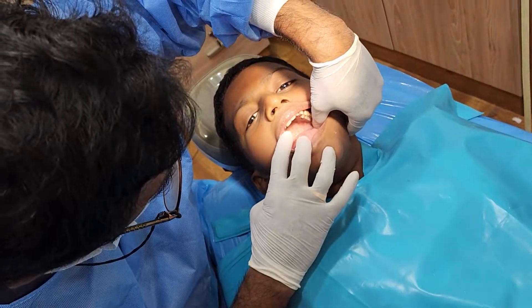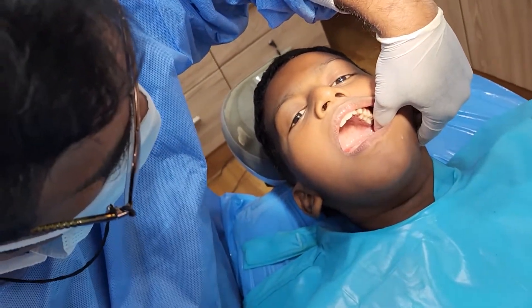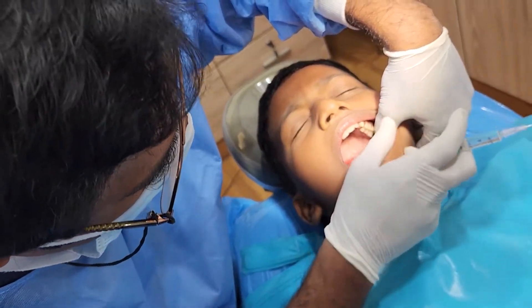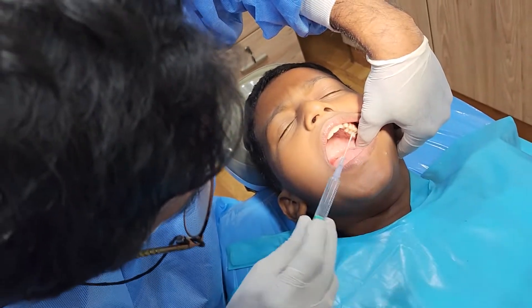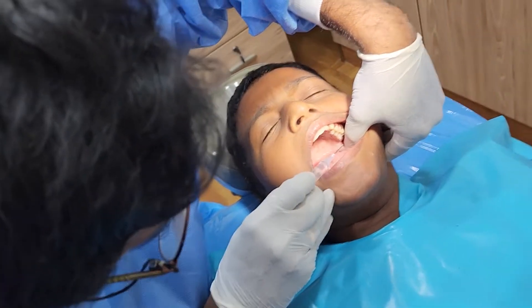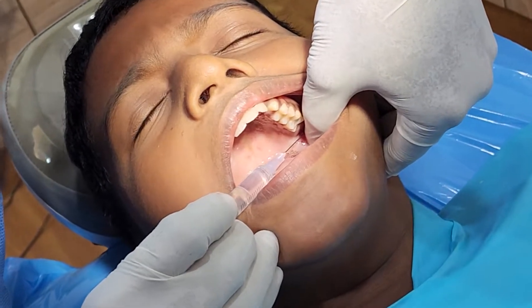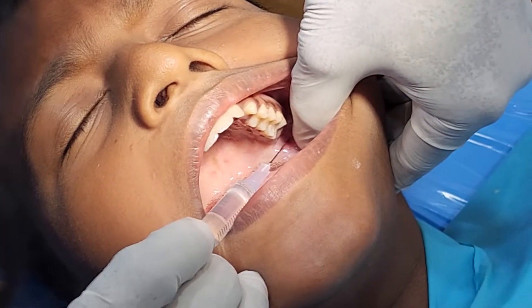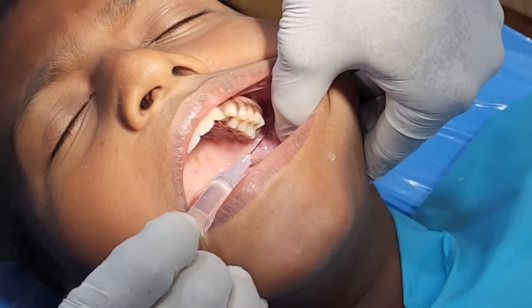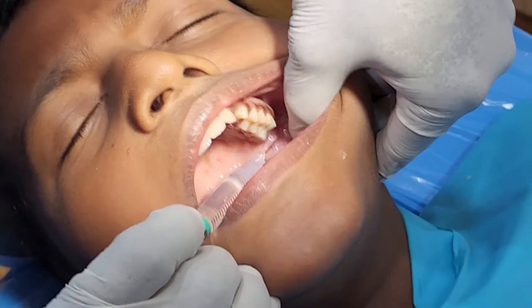I am going to affect the area so that my hands are there, and two-point discrimination comes into action here. This is how the two-point discrimination comes into action. And now I am going to distract the tissue.